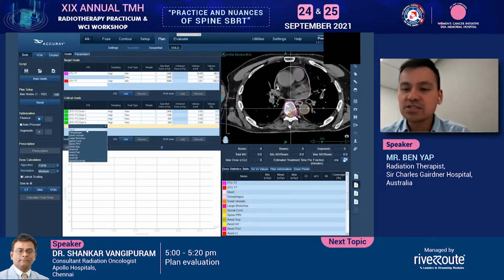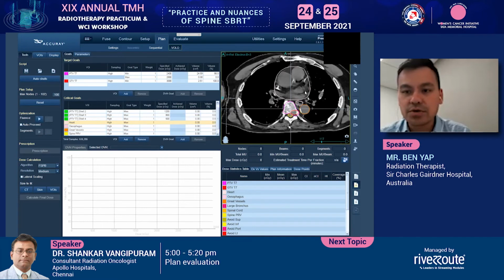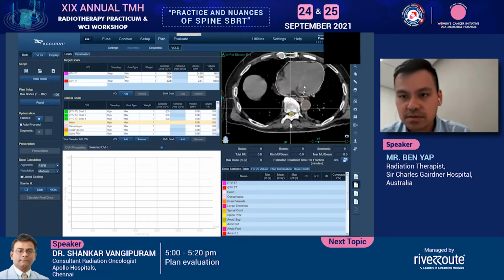So if we were to put each one of these individually, the heart, the esophagus, the greater vessels, and spinal cord PRV, and we want them high, you'll notice that my sample points have jumped up to over 600,000. Now that is very high. What that usually means is that if you were to hit play, each iteration will take a long time. And when you put heart in as a critical goal, it's actually going to go through your entire contour to apply that constraint.